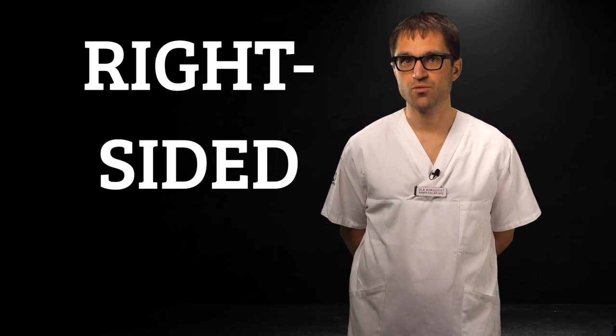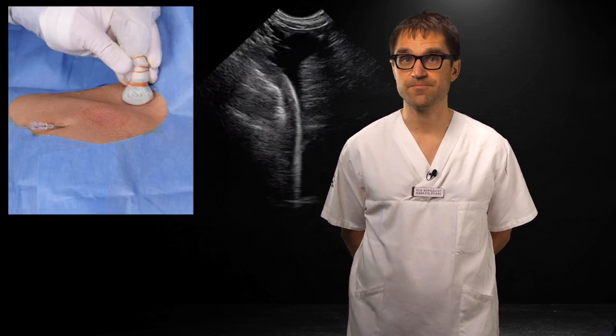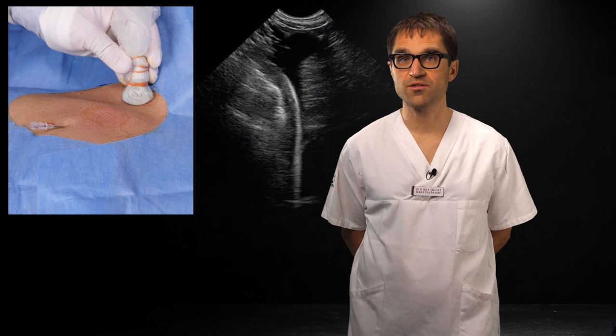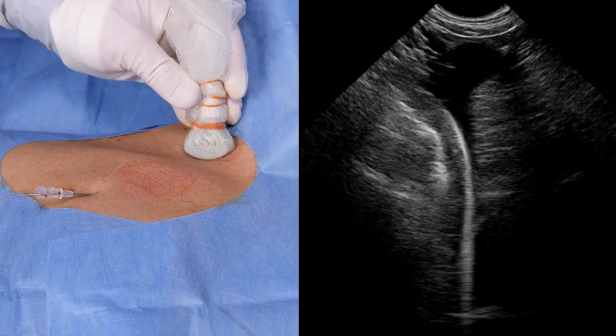You need to use good judgment about when to avoid a subclavian, when to abort a subclavian attempt, and when to call for help. Finally, your central lines should be right-sided, as the right side comes with one critical advantage: it allows for the supraclavicular fossa view, which is going to change your practice. You can confirm that the guide wire is in the right place before threading the catheter, and likewise a dislocated guide wire can be repositioned in real time.